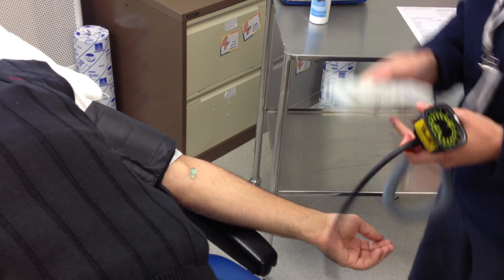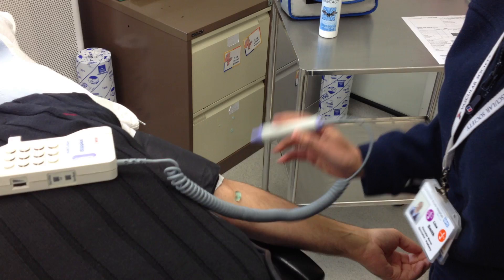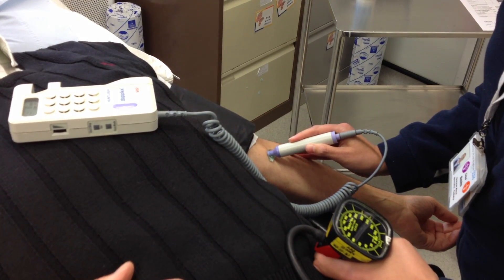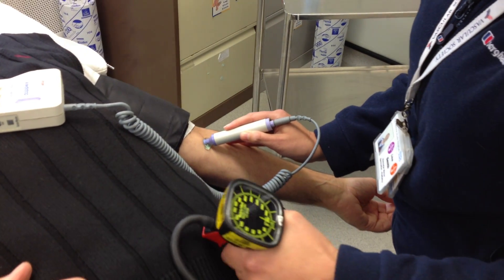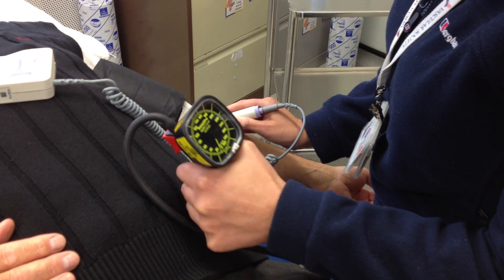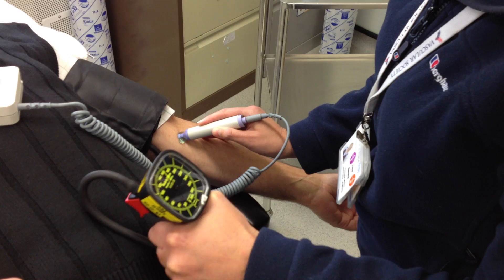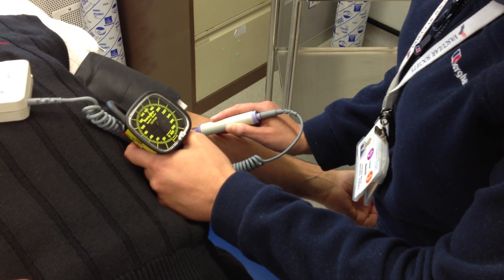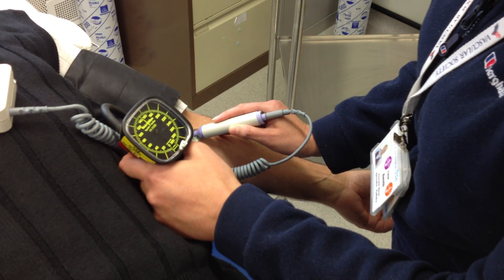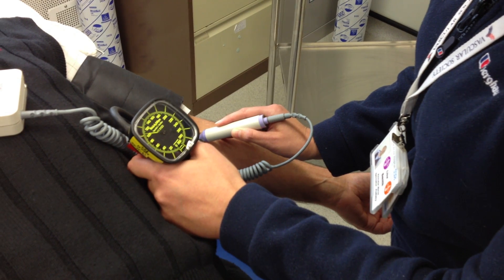Coupling gel is applied to the brachial crease. The pulse is located with the handheld Doppler unit. The hand is anchored onto the arm and the cuff is inflated. The probe is angled about 45 to 60 degrees to the artery. The cuff is inflated until 20mm of blood pressure above the last audible reading and then deflated slowly at about 2mm of pressure per second, then fully deflated rapidly.